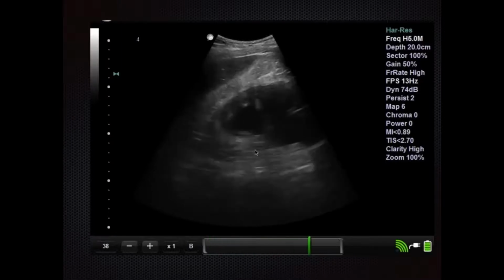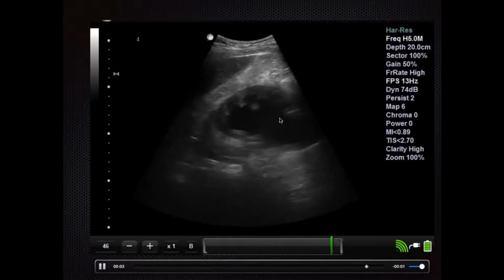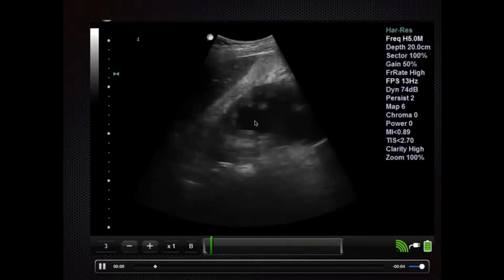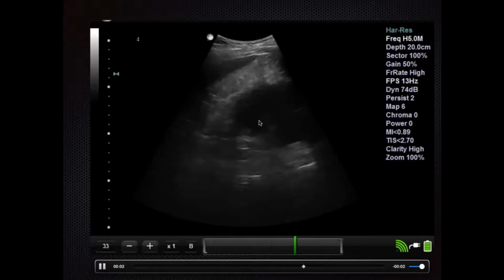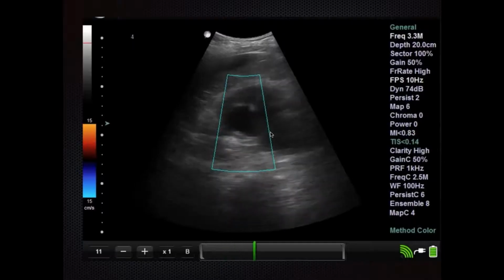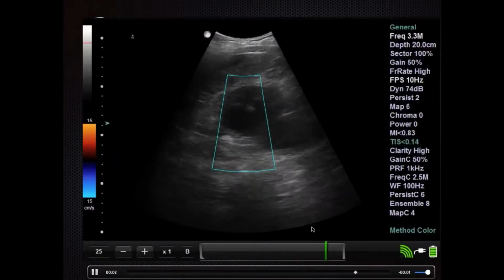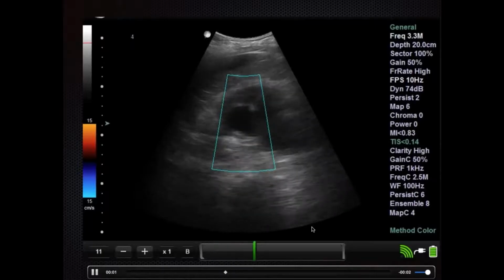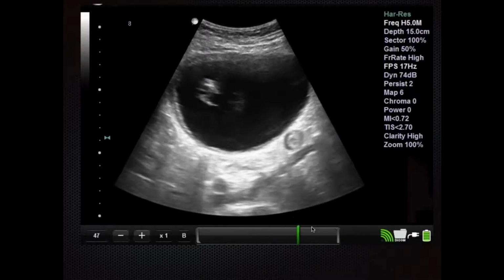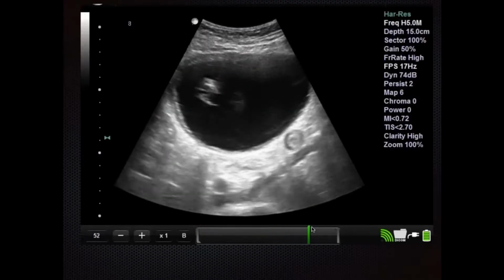Okay, so here's another patient that I saw, and you can see that in this patient, again, a clear anechoic region extends all the way to the minor calyces. And throw on Doppler, there's really no flow, so I'm not looking at an enlarged renal vein here. And then scanning further down on this patient, you'll see the bladder scan here.